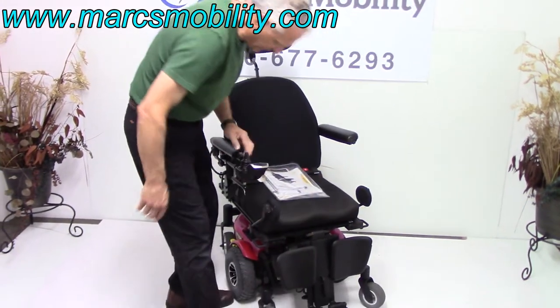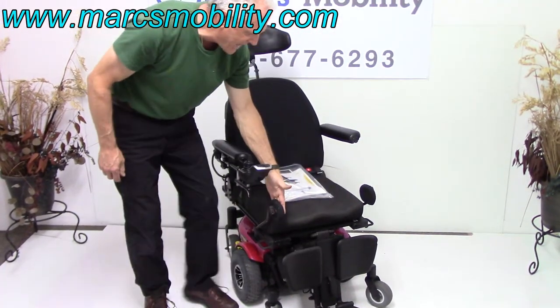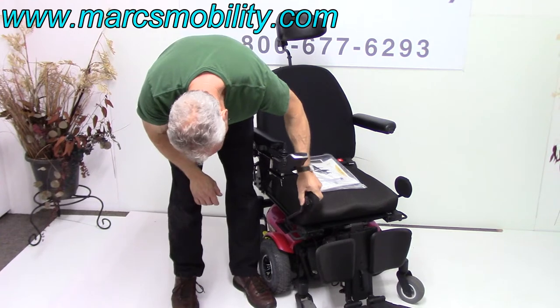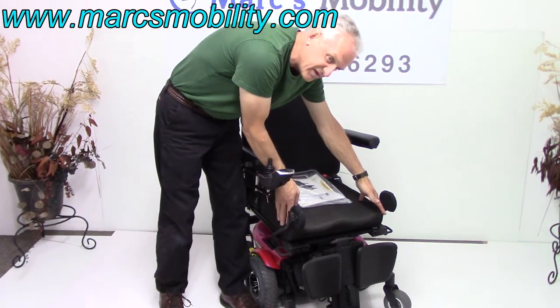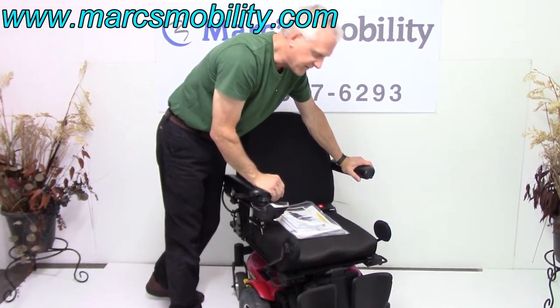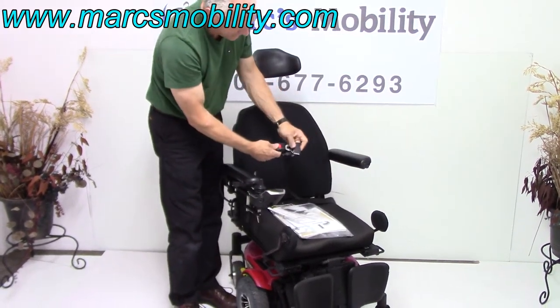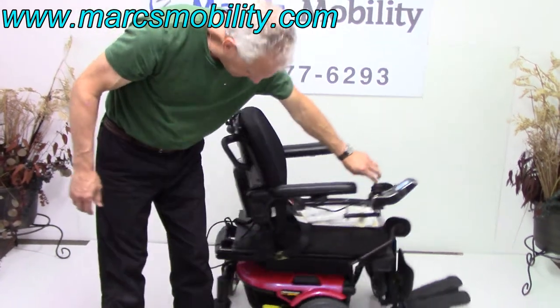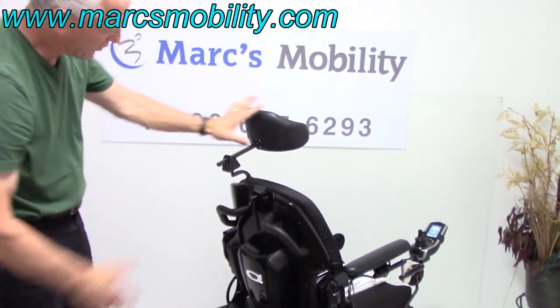These foot plates you can bring all the way in, you can flip them up, so when you get out there's nothing in your way. There are lateral pads for your knees here to keep your knees from going out — if you don't need those, they can be taken off. The seat is 17 by 18. This is a floating seat, meaning you can put your own gel seat or air seat. All the manuals are here for the chair. There's a safety belt. The arms both flip up for easy exit. You've got a push bar on the back, and an adjustable headrest that can be removed.